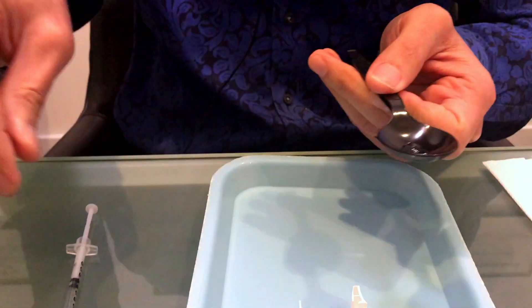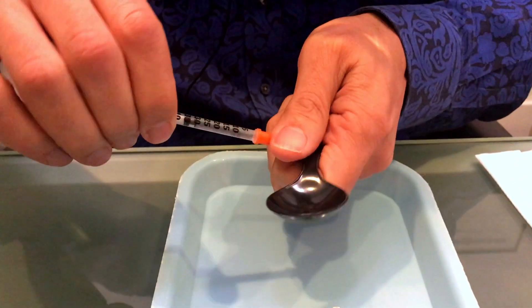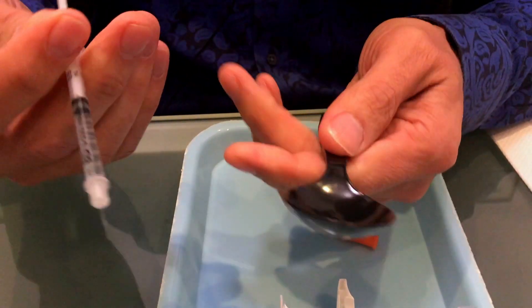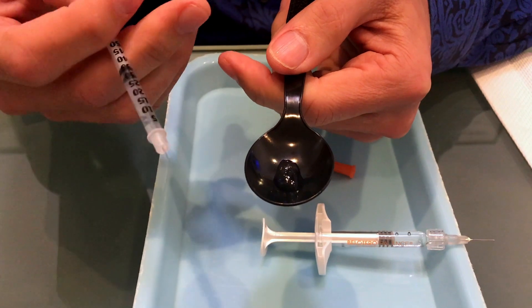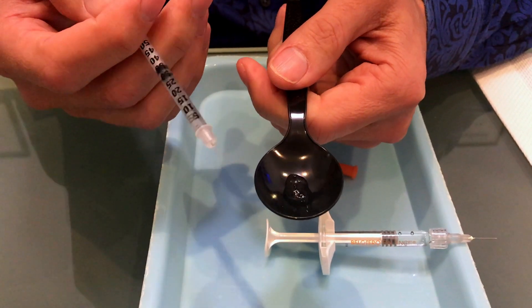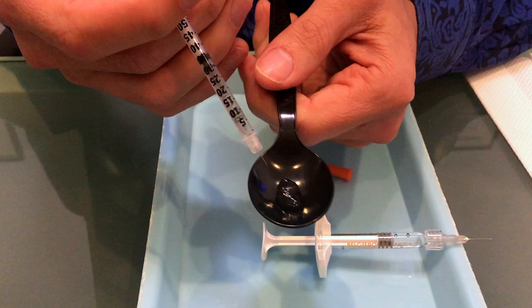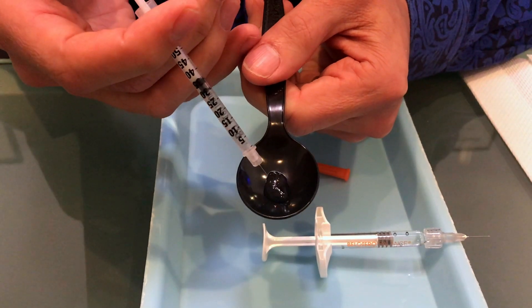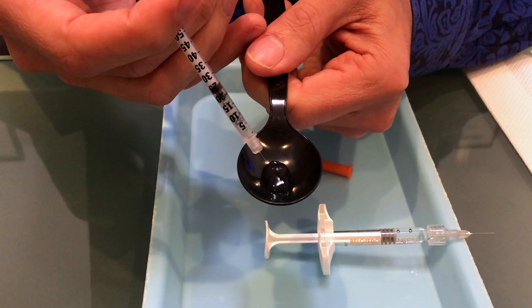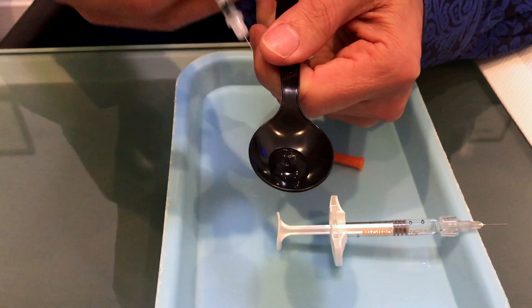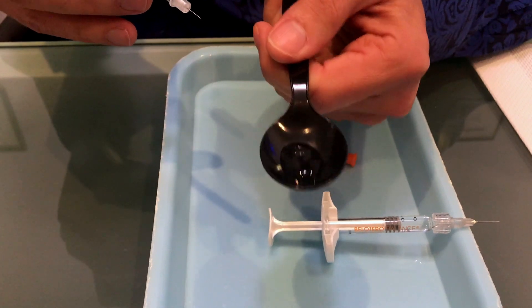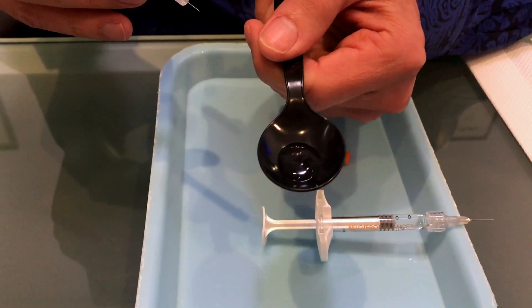Okay and now I want to put in some Hyaluronidase. It's Hylinex and what I've done is I've drawn up 0.3 cc's which is 45 units of Hylinex. I'm going to put this onto the filler and we're going to watch how it dissolves and I don't know if this is enough but we're just going to watch and what you're going to see is that it dissolves it very quickly.